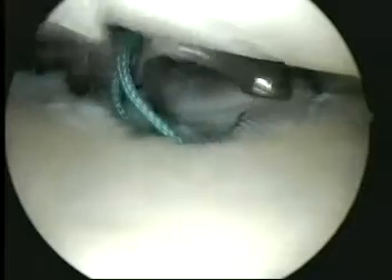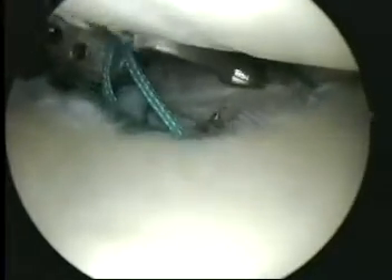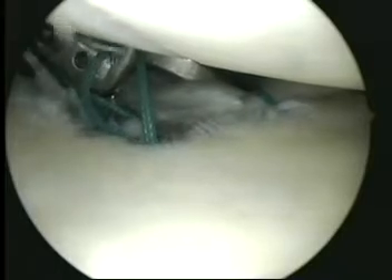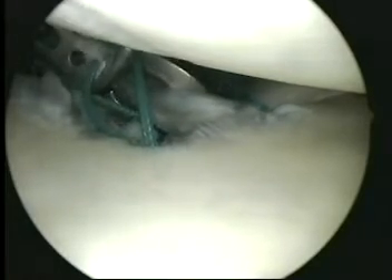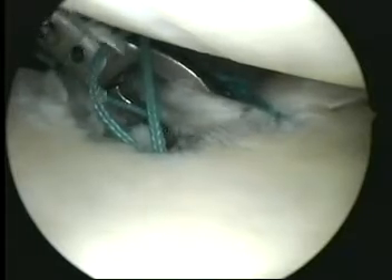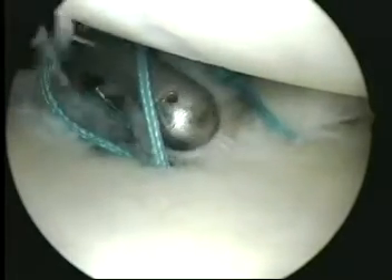The arthroso device can also be used to place the suture through the capsular tissue. The suture passes from one jaw to the other, pulling the suture through the capsular tissue.